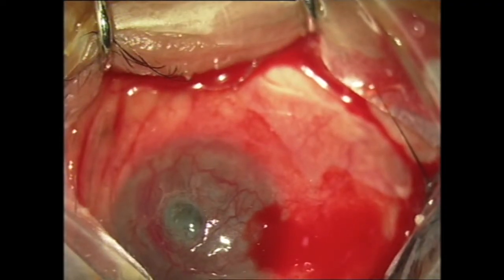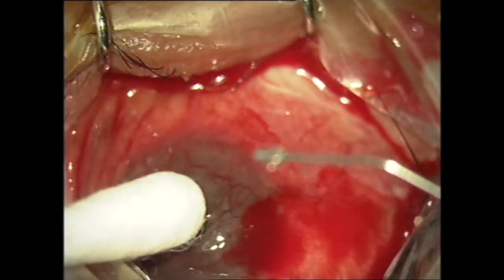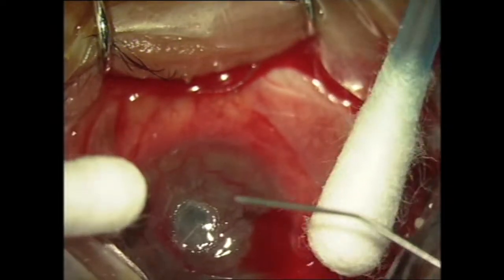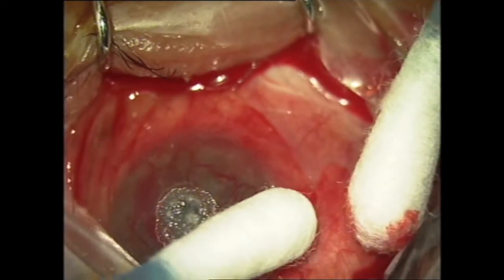When this glue is applied on the ocular surface, the liquid monomers of the cyanoacrylate rapidly polymerize into solid polymers in the presence of anions. Glue is most commonly applied under topical anesthesia on the slit lamp. If there is corneal perforation, the procedure is performed in the operation theatre.